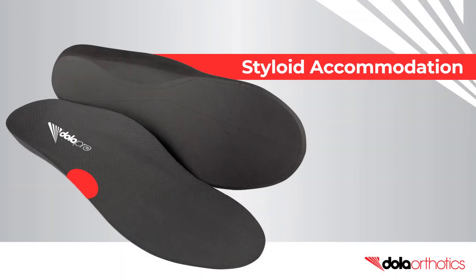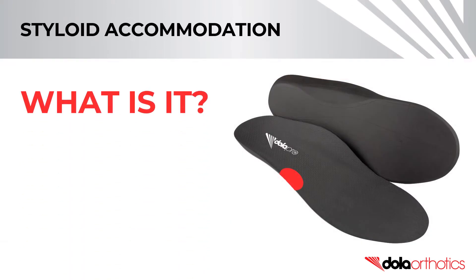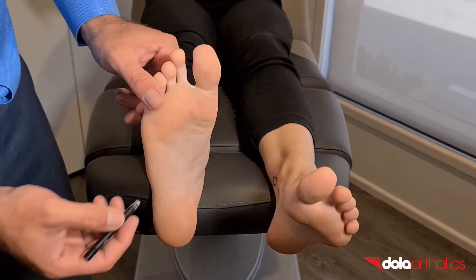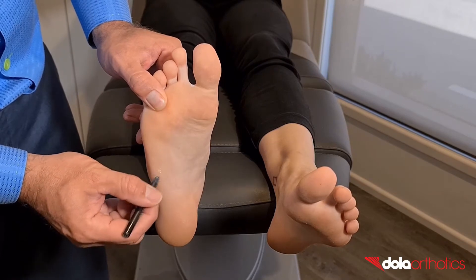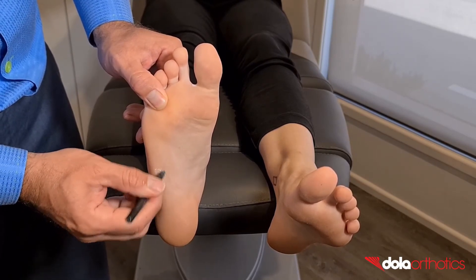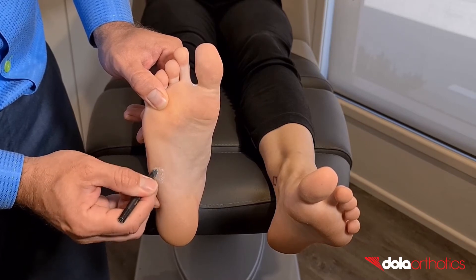How to customise your Dola Pro with a styloid accommodation. A styloid accommodation is a partial thickness indent on the dorsal surface of the orthotic under the 5th metatarsal styloid process. In this video, we will show you how to complete a styloid accommodation in clinic. An accommodation involves marking the position of the styloid on the orthotic device.